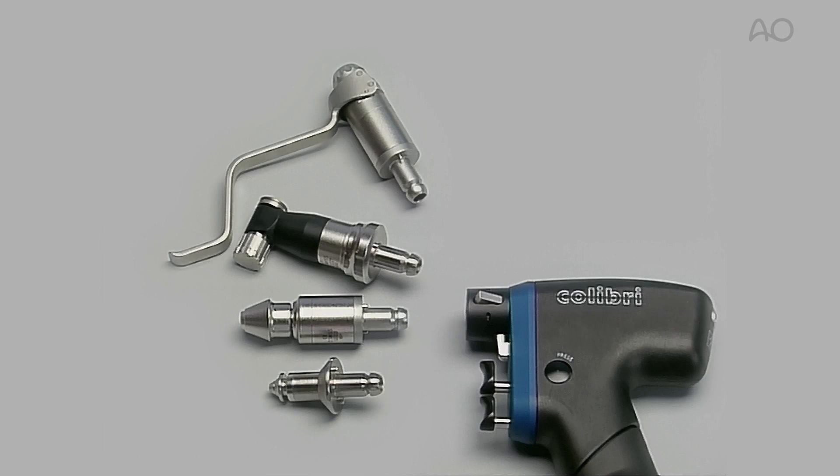The four main attachments for use on small bones are the mini quick coupling, the standard quick coupling, the oscillating saw attachment, and the quick coupling for Kirshner wires.